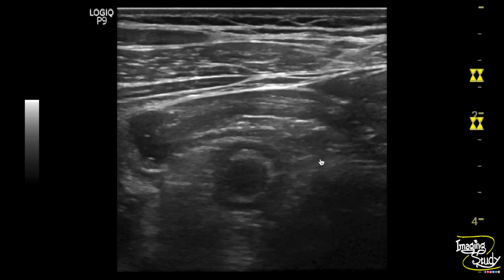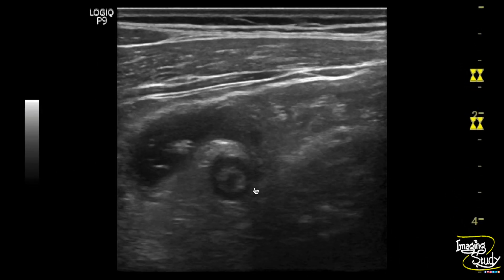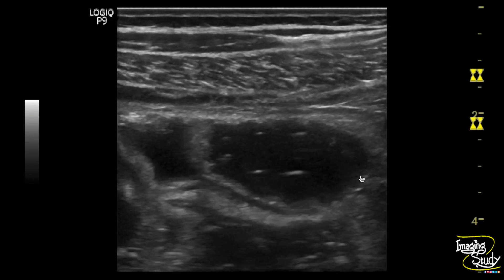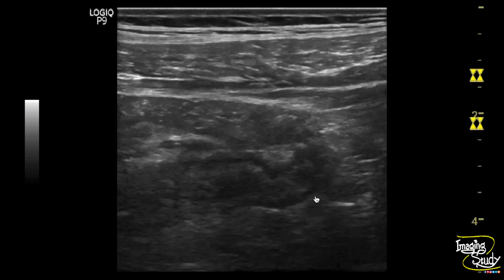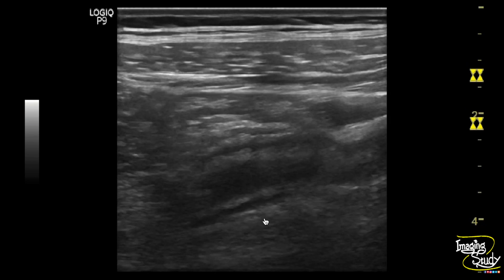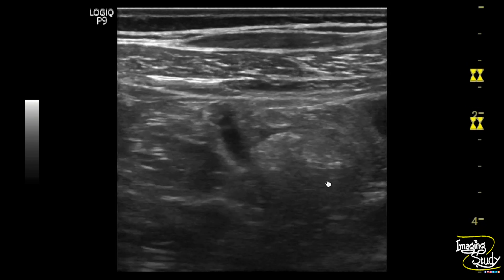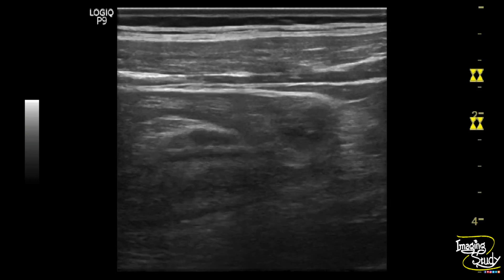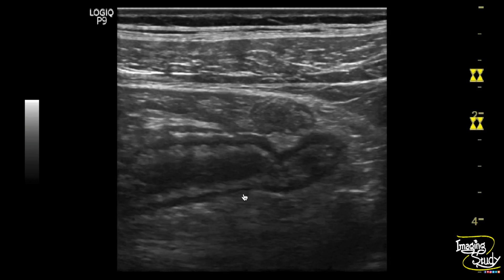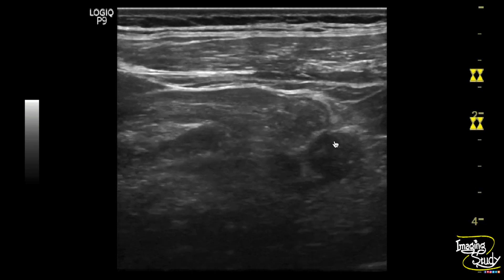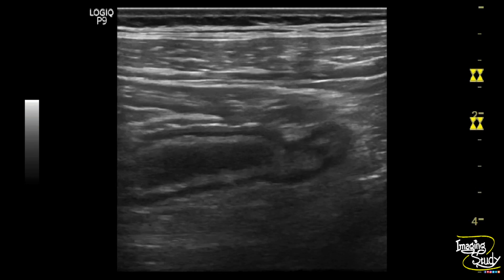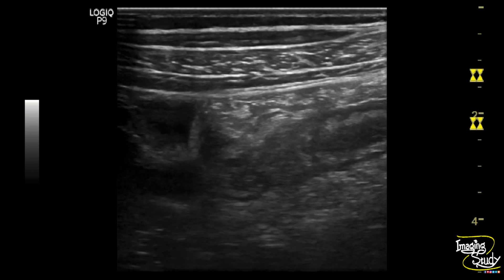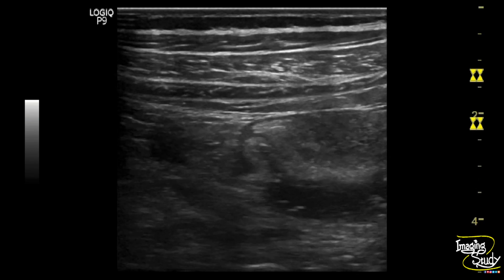Here you can see the right iliac fossa showing a blind-ended distended non-compressible tubular structure of intestinal origin. You can see the gut signature present. The structure is connected to adjacent cecum. There is no significant collection adjacent to this structure. You can see a hyperechoic fat stranding surrounding it. So this blind-ended non-compressible tubular structure is the vermiform appendix which appears to be dilated, indicating acute appendicitis.